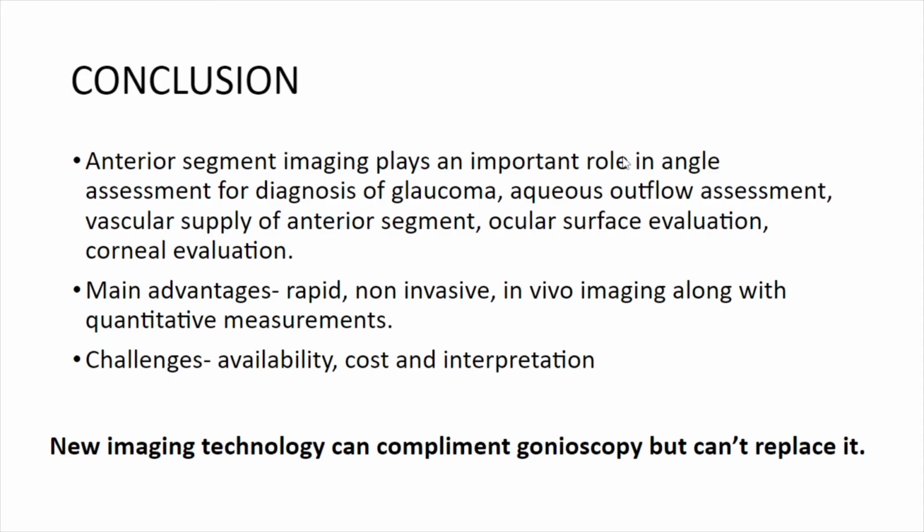So in conclusion, anterior segment imaging plays an important role in angle assessment. It is rapid, non-invasive and in vivo along with quantitative measurements, but the availability, cost and interpretation remain a challenge. So we should always use it to complement gonioscopy, but we cannot replace gonioscopy with it.